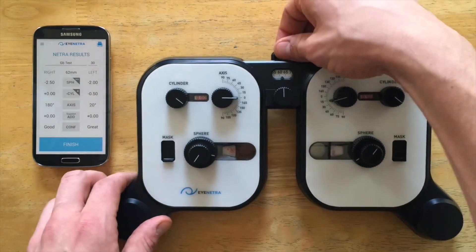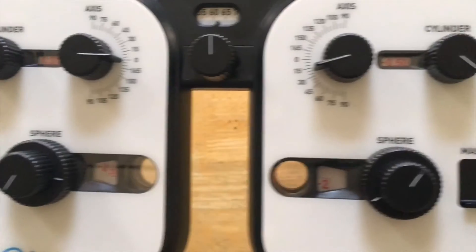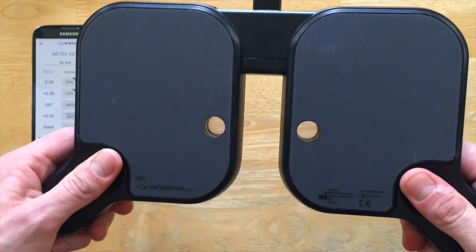Very good. And I'll simply pull up the tab to lock it. Just double check all those values. Looks pretty good. Then I'll hand this to my patients and have them take a look.